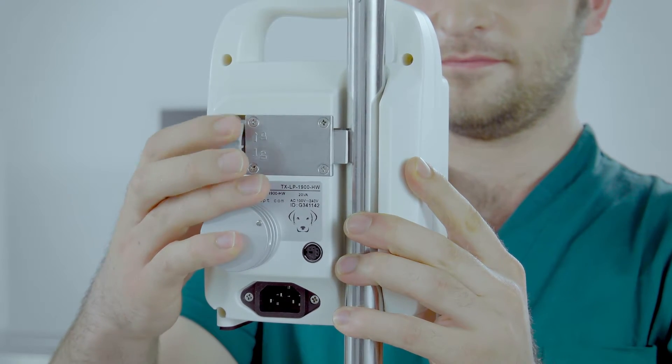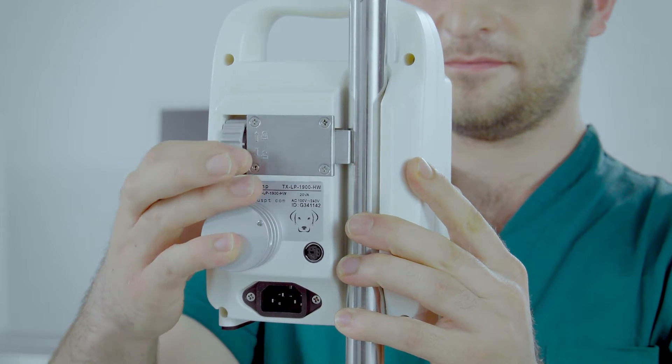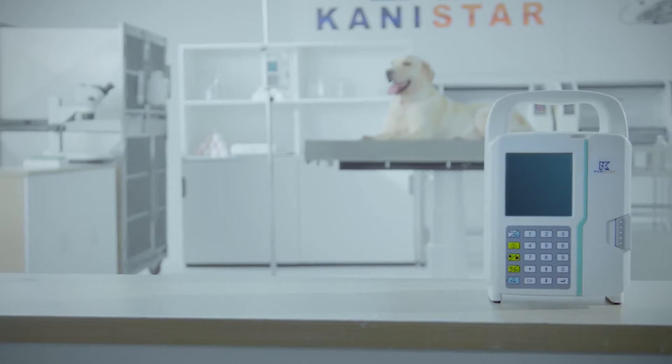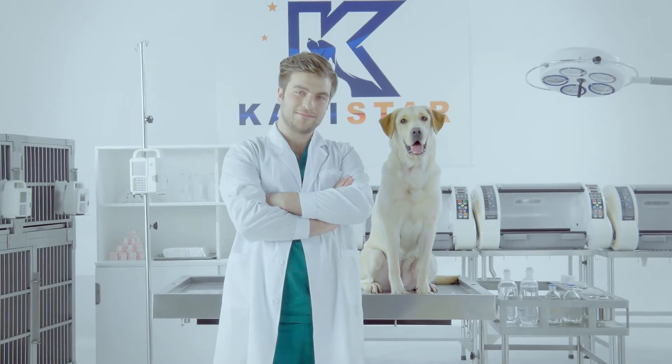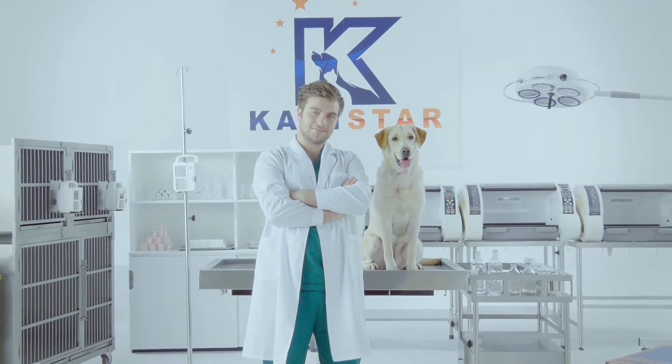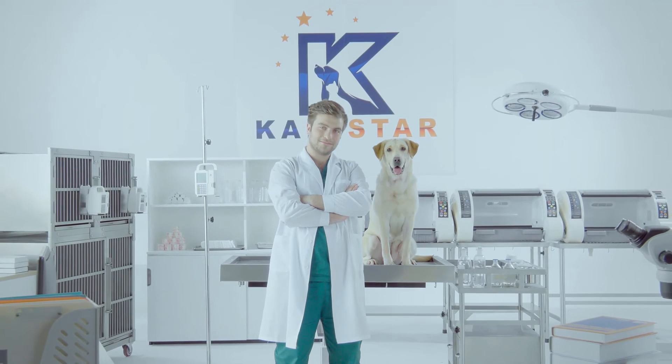Easily mounted to cages, doors, or infusion bars. Canistar TransVision LP1900 Infusion Pump — a truly pet-orientated infusion pump. Presented by Canistar Group.